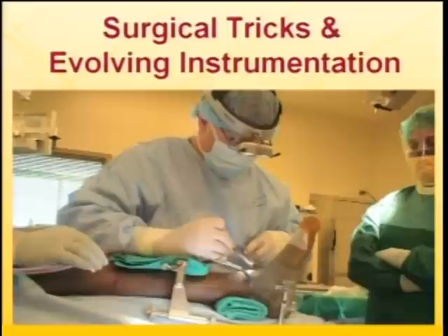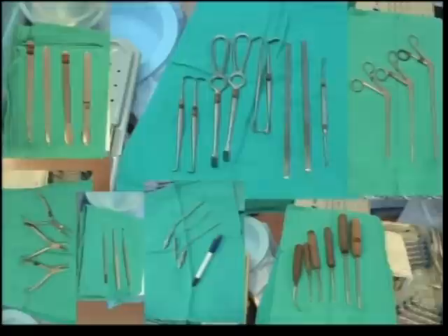Now, tricks and evolving instrumentation that may help us to operate minimally invasively are starting to emerge, but for the last 10 years, we've been using conventional instruments in an unconventional way. I think it's important to have passion for your surgical tray, as I learned here, and so get familiar with all the things you can use through a small window, because you're already compromised, possibly, by your approach. So you have to be able to work through that window.